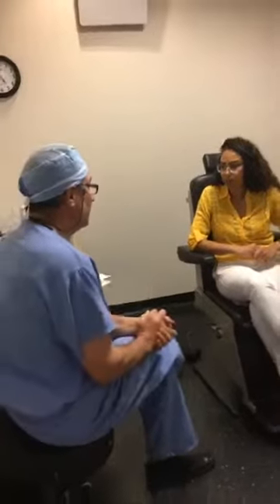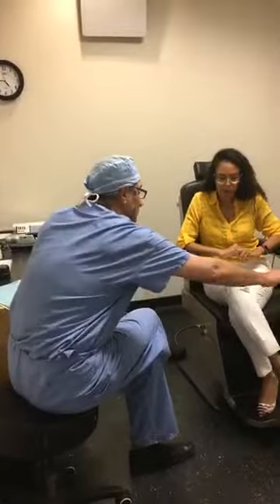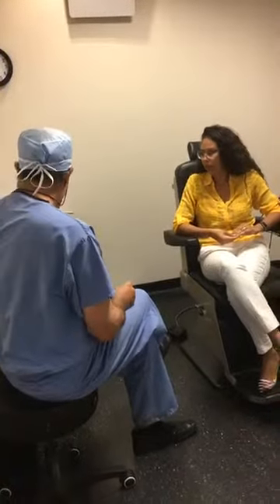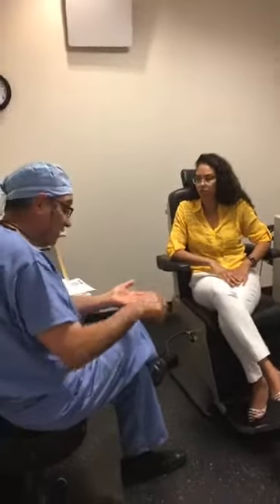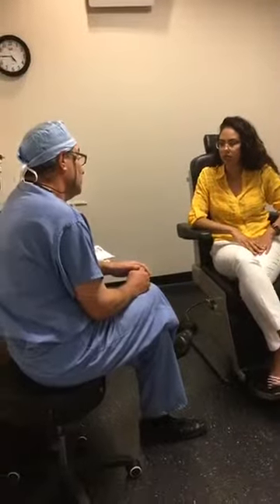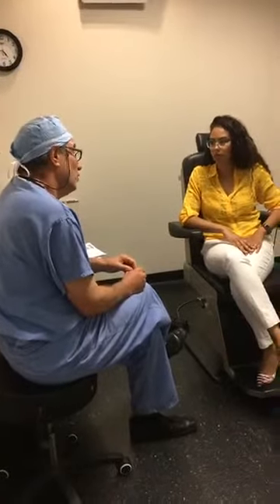What questions can I answer? What kind of LASIK surgery do you think I'm a good candidate for? So we pretty much only do what we call the all laser LASIK now. That means that we use one laser called the femtosecond laser, which makes the flap, and then the other laser does the wavefront shaping. So it's called all laser LASIK because no blades touch your eye or anything like that. The flap is made with one laser and then the shaping is done with the other laser, and that's just called all laser LASIK. That's the best. That's pretty much only what we do now.